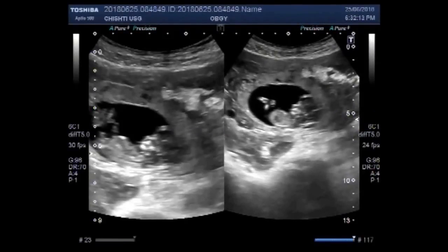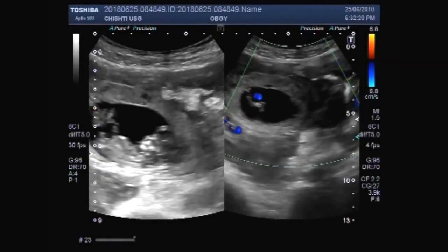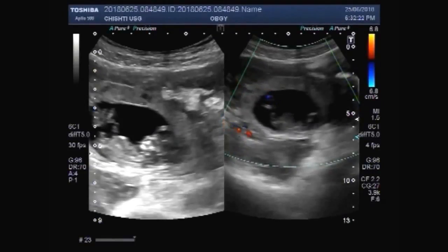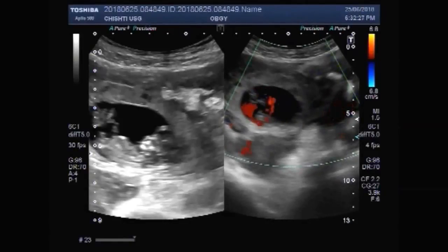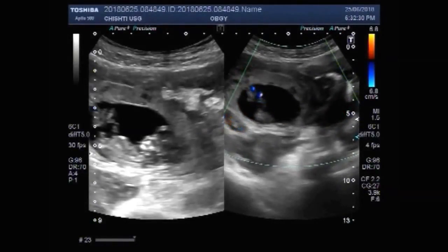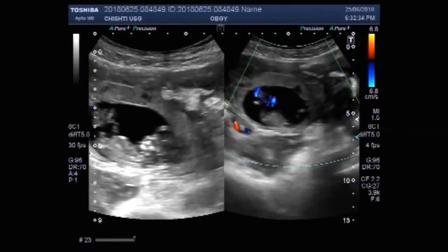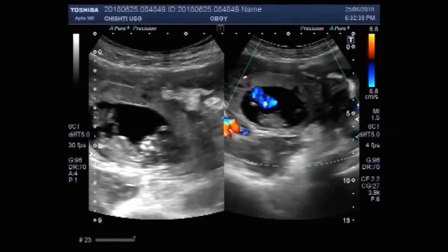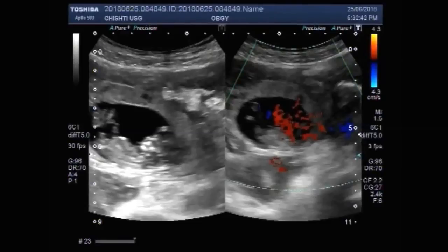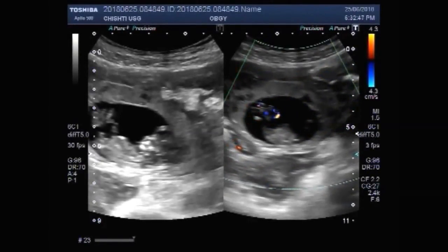Again the fetal movements are seen. Again blood flow is visible, and the fetal movements are also visible.